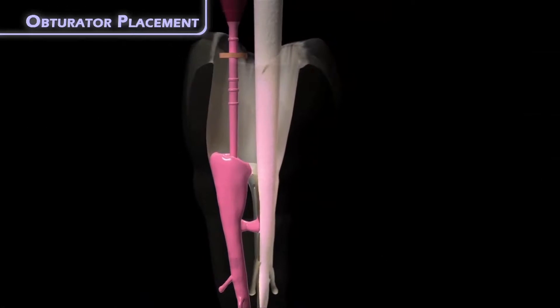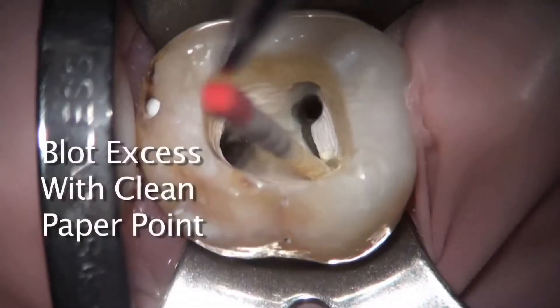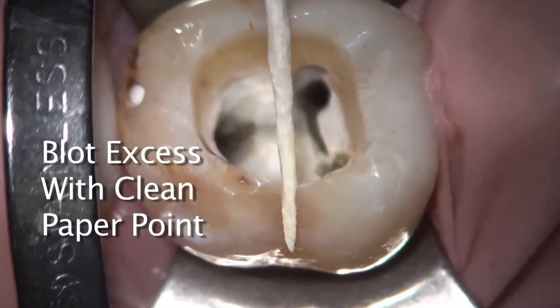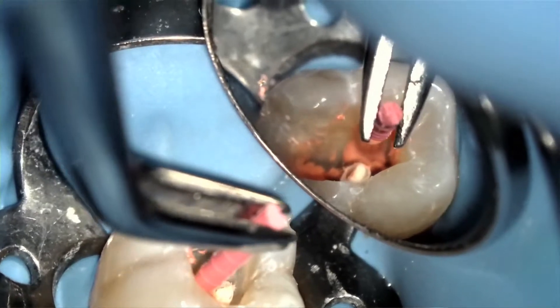In teeth with multiple canals, which benefited from blocking out adjacent canals, you may at this time remove the paper point from the next canal to be obturated. And of course, prior to obturating that canal, line the canal with a bit of sealer and proceed with the gutta core obturation as I've just shown.